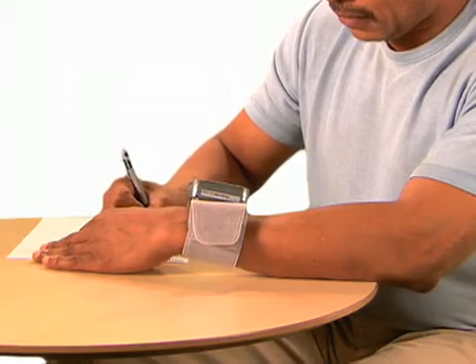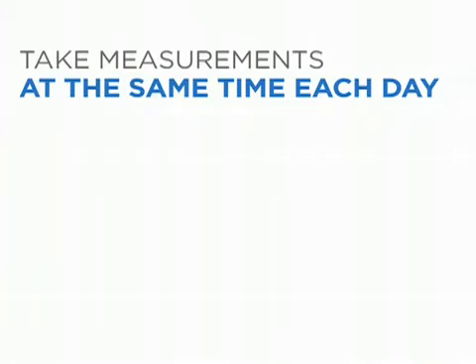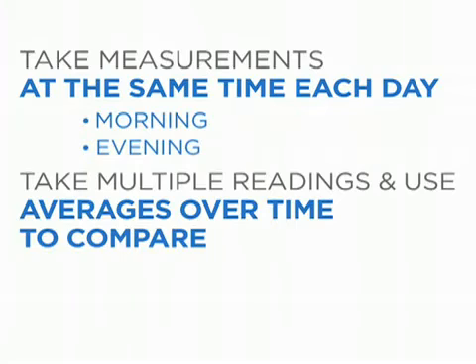Make sure to record your reading. Press start stop to turn off the monitor. It's important to take measurements at the same time each day and use averages over time to compare readings.